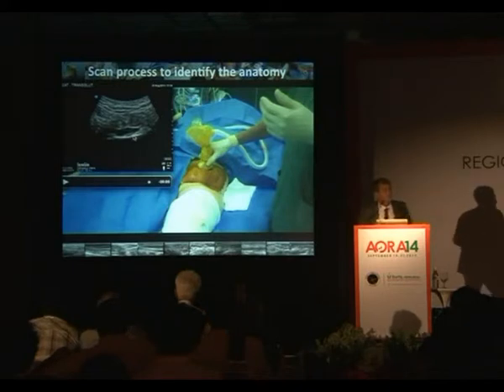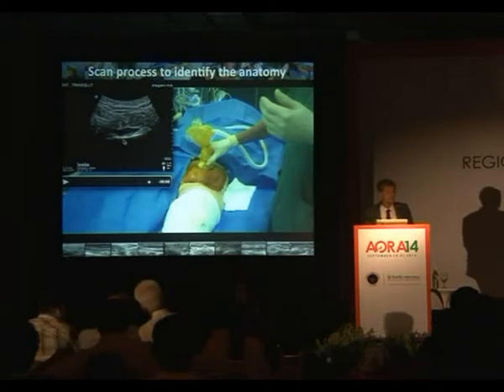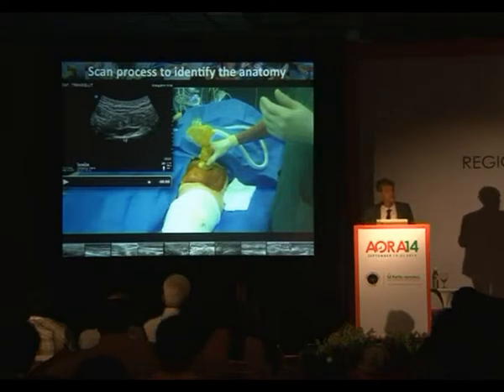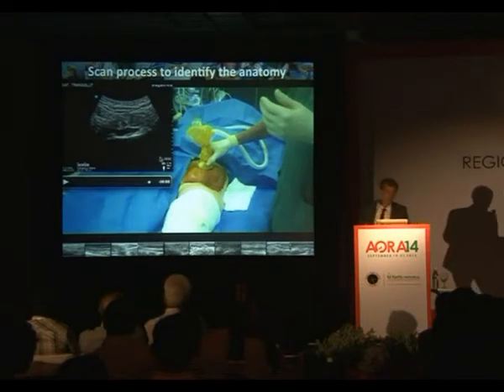On a very fat patient, I will not see anything because I will have everything gray, but I know that I can put my needle there. I have no risk to go deeper because I will have a bone contact. So I just have to put my nerve stimulator, in case the sciatic nerve is on the way, to identify the sciatic nerve. If not, I just put my needle there, I inject some dextrose 5%, and suddenly the dextrose will create the space around the nerve and I will see the nerve and I can inject my local anesthetic.